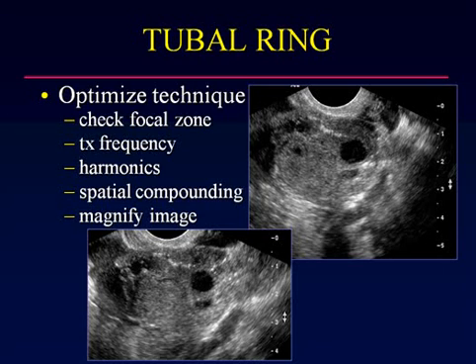So in this particular case of a woman who was pregnant with pelvic pain and had an empty endometrial stripe, you can see that there is an adnexal mass. It's relatively amorphous. The ovary is here. There's some hemorrhage here, a suggestion of a tubal ring and some adjacent free fluid. So certainly you're very concerned about the possibility of an ectopic pregnancy, and this would fall into that tubal ring category of high but not 100% specificity.